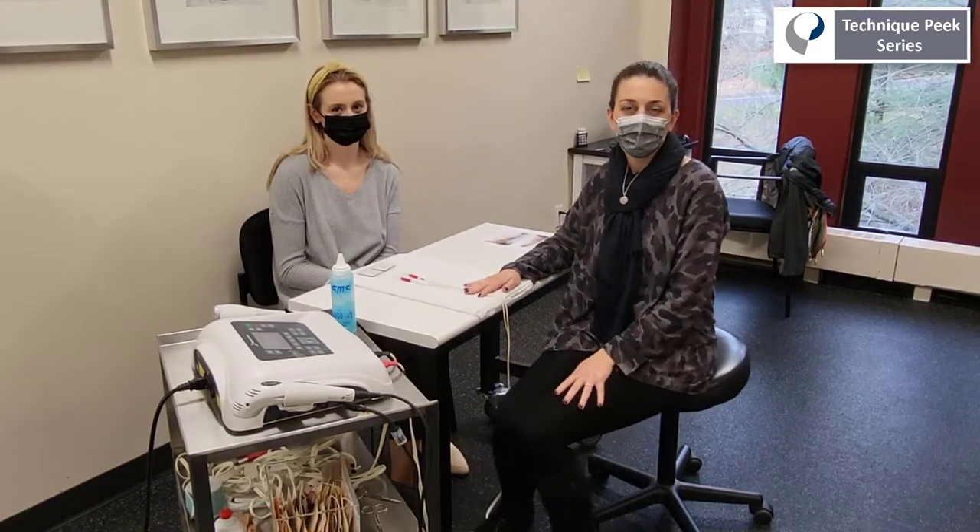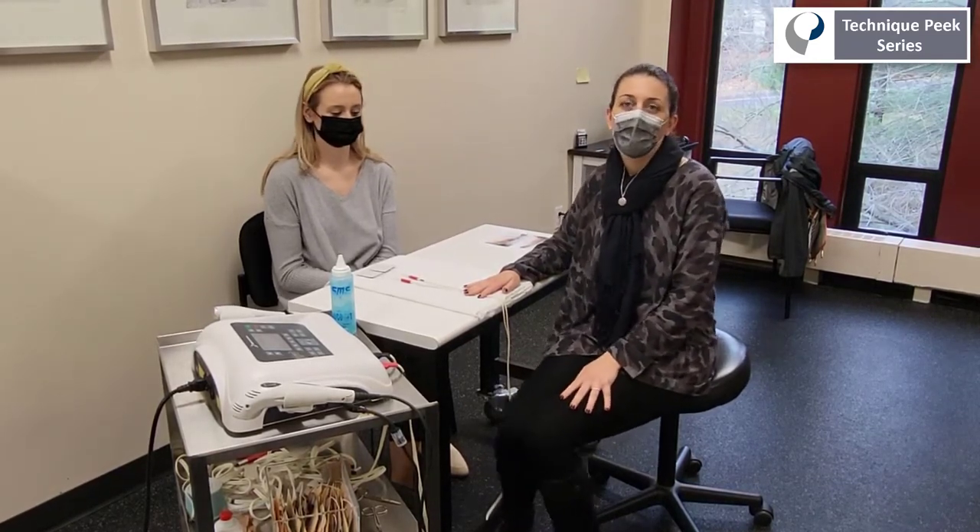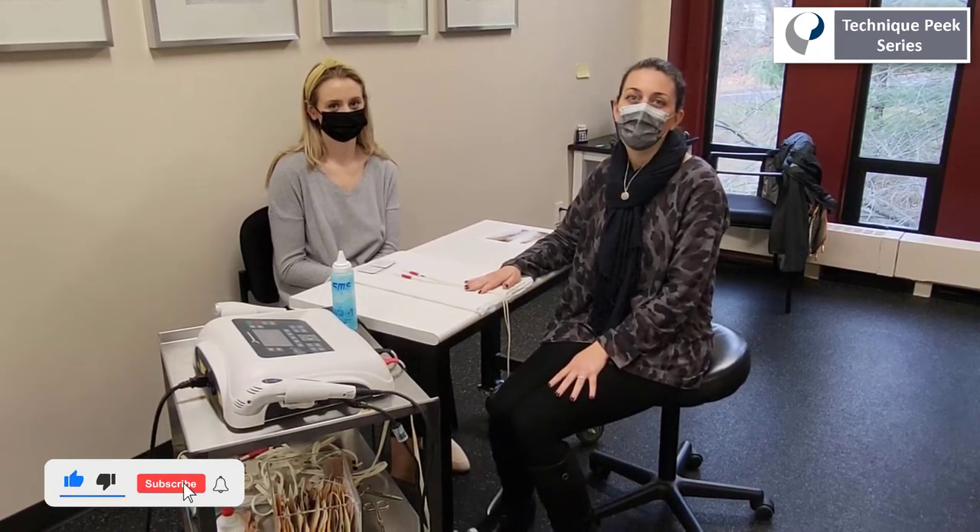Hello. Today we're going to talk about a technique to locate motor points for use with functional electrical stimulation when trying to elicit a specific muscle contraction.